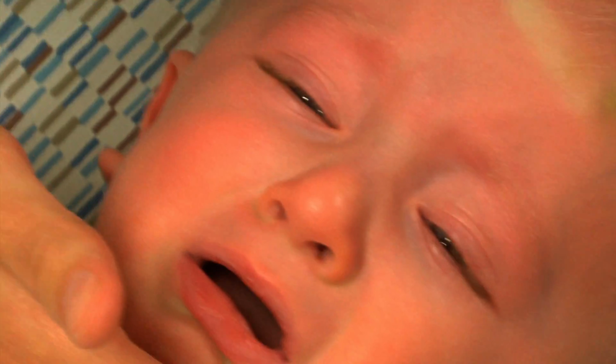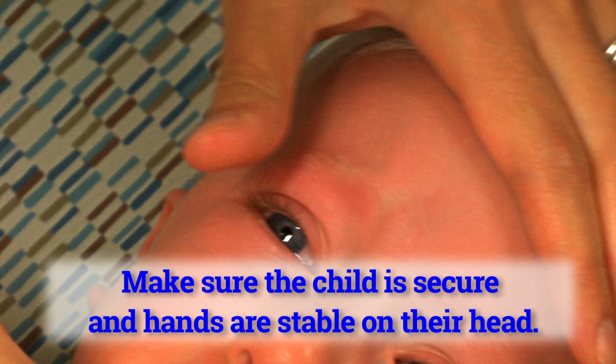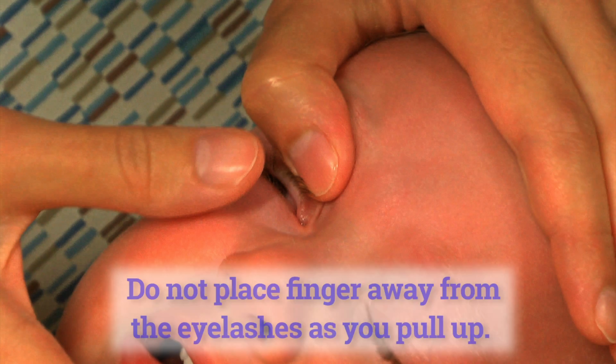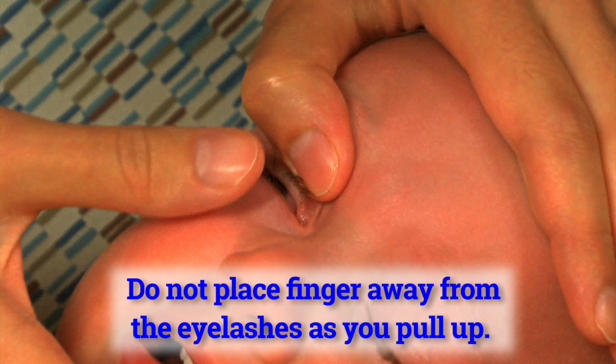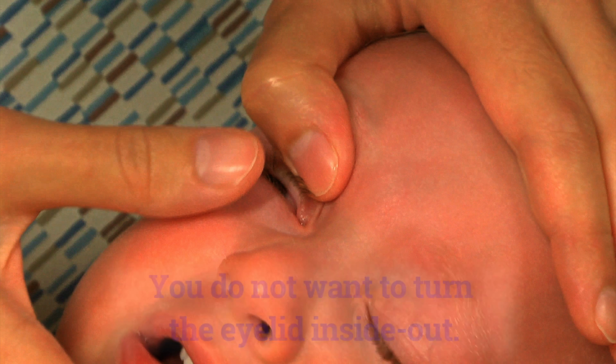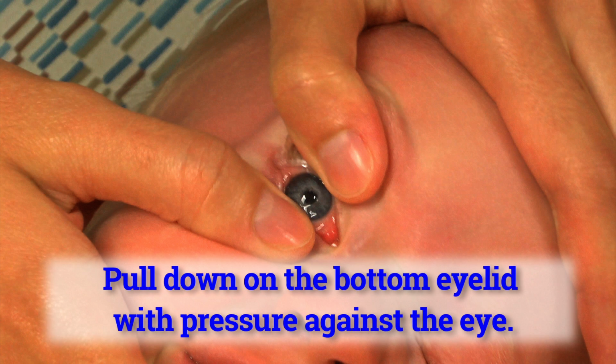When removing the contact lens, again, make sure the child is secure and that your hands are stabilized on their head to prevent sudden movements. Do not place your finger away from the eyelashes as you pull up, as you do not want to turn the eyelid inside out as you try to remove the lens. With the top lid secure, pull down on the bottom eyelid, again, being sure to keep pressure against the eye to avoid turning the eyelid inside out.